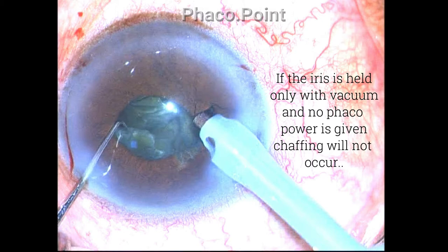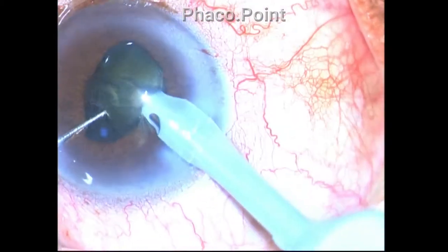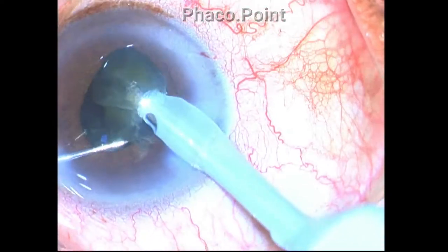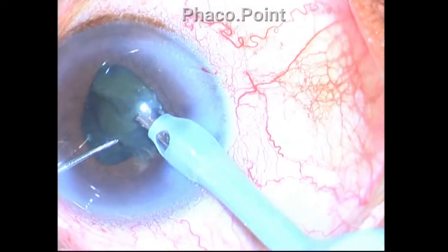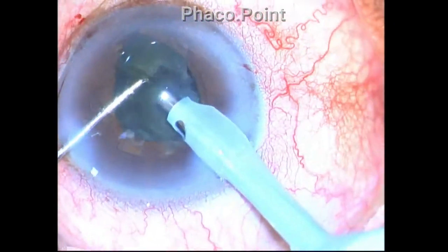Significant chafing did not occur at that point. Chafing occurs not because you hold the iris, but because you apply phaco power while holding the iris — that is why the portion at around seven o'clock did not get chafed, even though I held it.